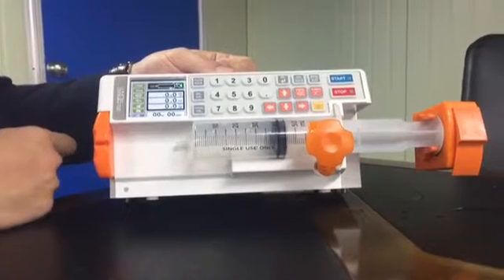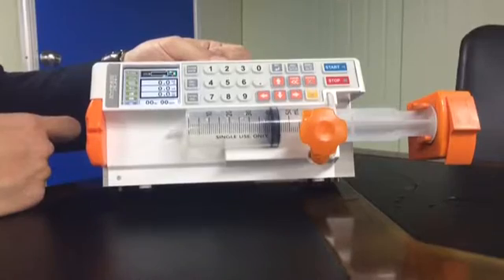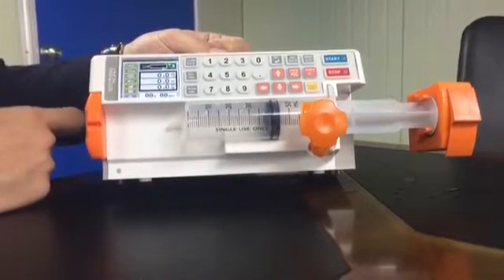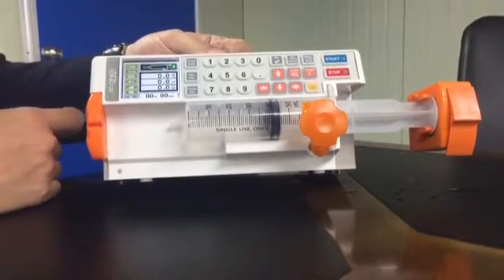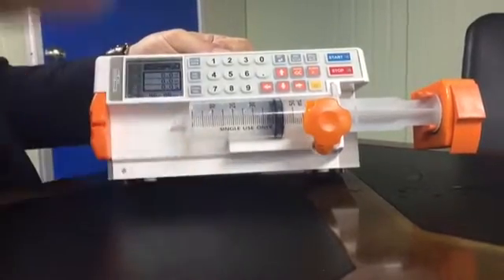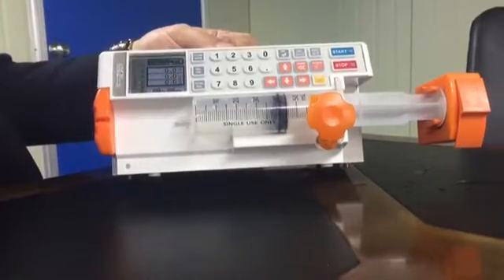The flow rate means how much medicine you want to infuse to the patient — how many milliliters per hour. The delivery volume is the total volume that you want to infuse to the patient. And the total volume shown is what has already been infused. It depends on the flow rate, so flow rate and delivery volume are what you choose.